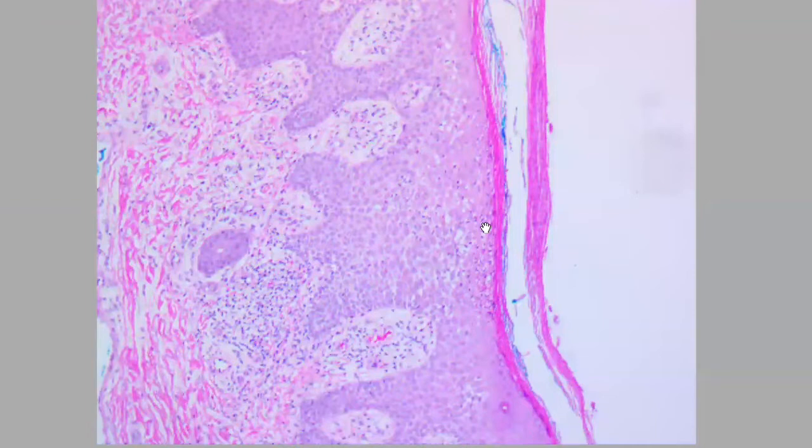So this is a key feature for psoriasis. And when we see neutrophils in the epidermis or in this layer, we need to do a PAS stain just to exclude any fungal infection that can happen with increased neutrophilic count in this area. So this is one of the key features of psoriasis. And as mentioned, when these neutrophils accumulate or are present in one area with large numbers, they can form microabscesses, and this is called the Munro's microabscesses. We will see this at higher magnification, but I hope you can appreciate that we have here some neutrophils.